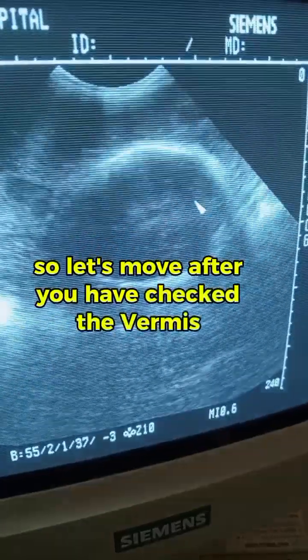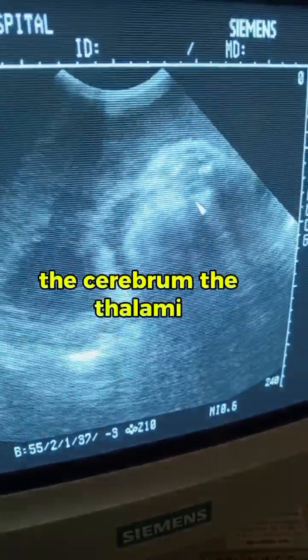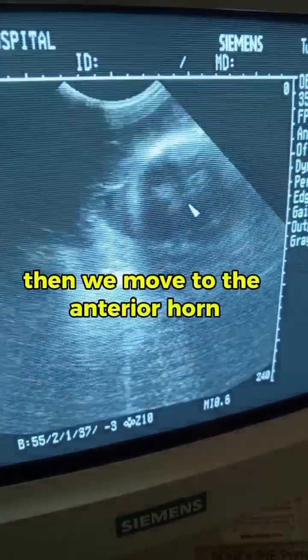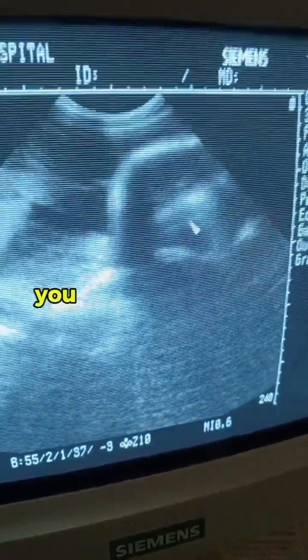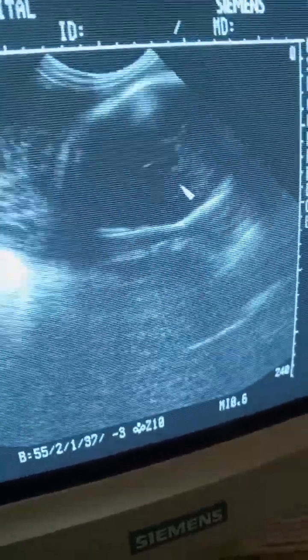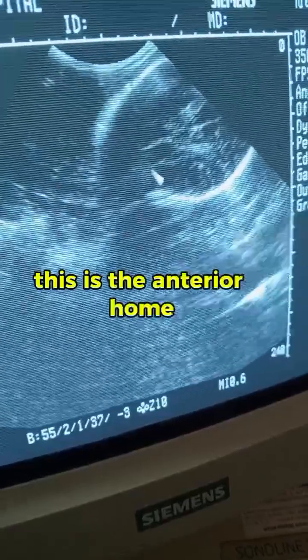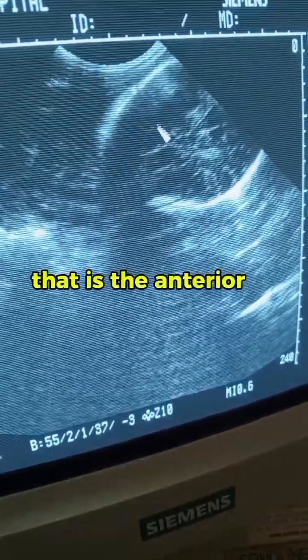After we have checked the vermis, the cerebrum, and the thalami, then we move to the anterior horn of the baby. You can see it here. This is the anterior horn. One of it is here, another one is there.